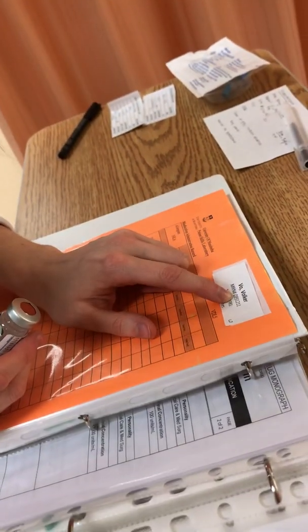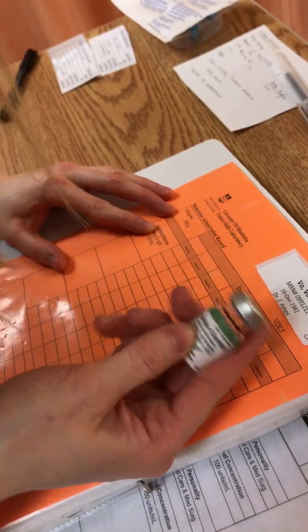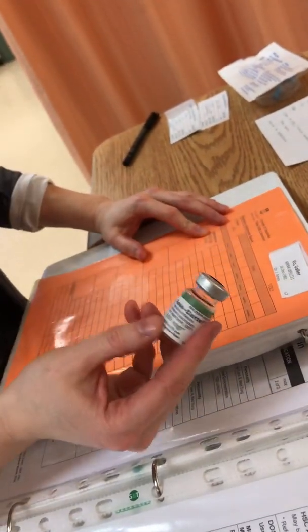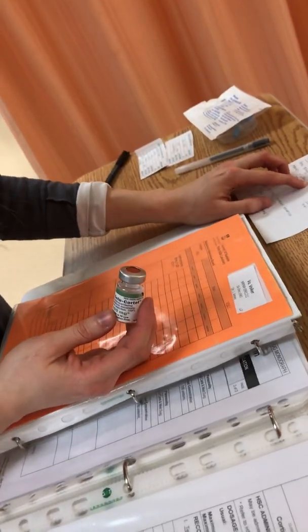I've got Volvoker number 0991211. That's the right patient. I've got the right drug, hydrocortisone, which I know from the drug monograph is Solucortef. This is Solucortef, so that's the right drug. I'll be giving 80 milligrams of this 100 milligram bottle, which because of my calculation, I know will be taking up 1.6 ml.